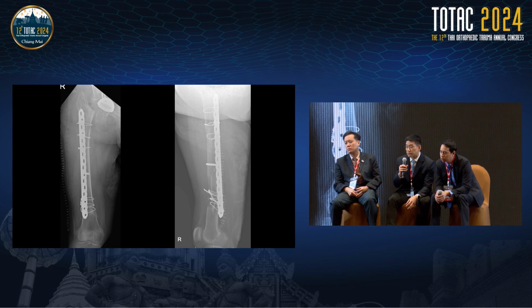Because the fracture is really long, extending from the isthmus toward the supracondylar area, and the bone stock above is not so good, and I think the fracture line also extends toward the proximal metaphysis, I might use a cemented stem with a distal femoral LCP overlapping the cemented stem above. This is my opinion. Thanks.